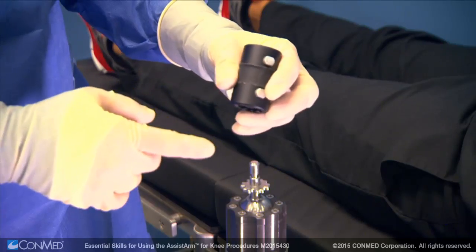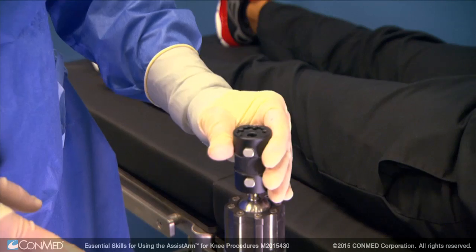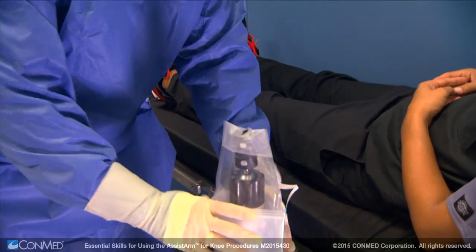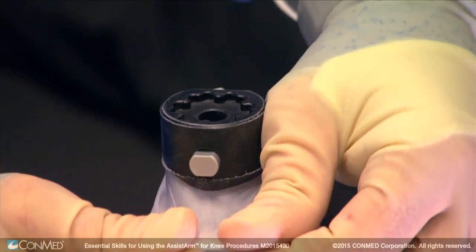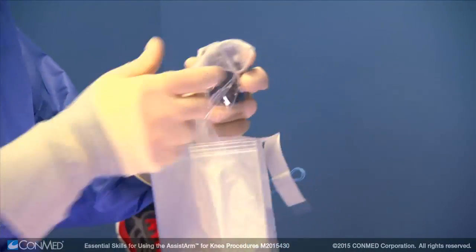The first way is to install the connector to the Assist Arm. Give the connector a slight tug to make sure it has installed properly. Then place the sterile drape over the connector and pull the connector through the tapered rubber hole of the drape until it rests in between the two silver buttons of the connector.